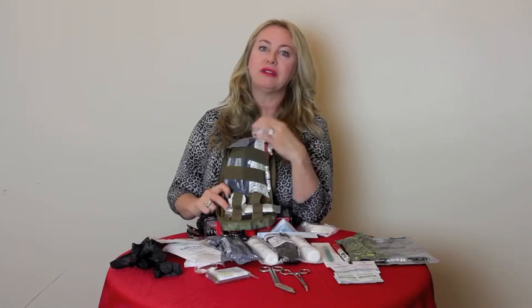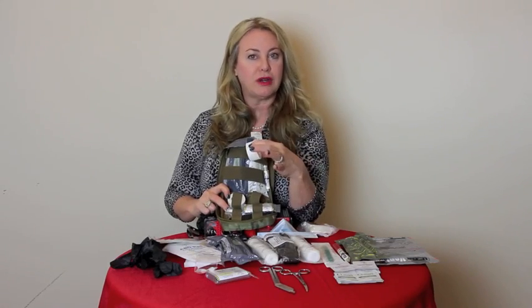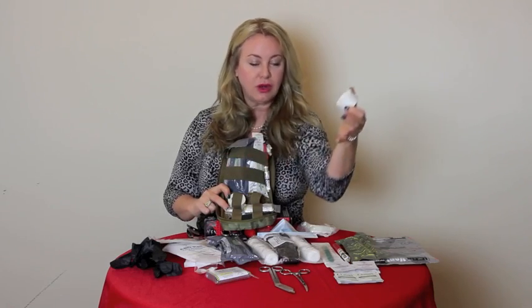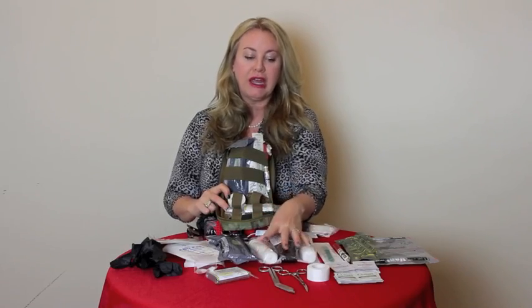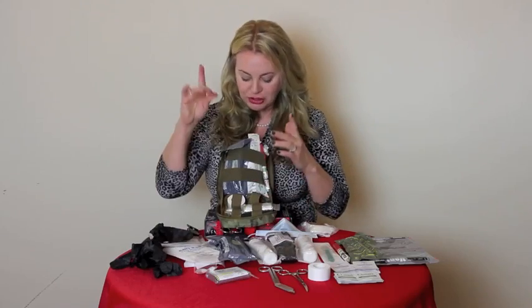And this would be obviously something you would be doing after you've stopped the bleeding. You wanted to dress the wound. If you were transporting the patient to a hospital, you can use this tape. You can use the dressings that we have in here that are sterile, and you don't have to worry about giving the patient some allergic reaction.